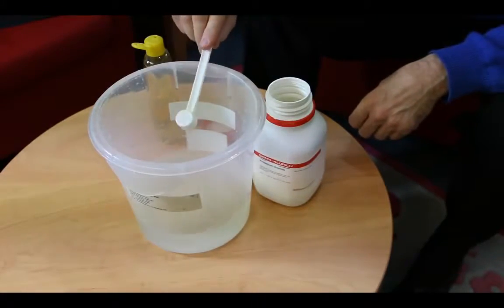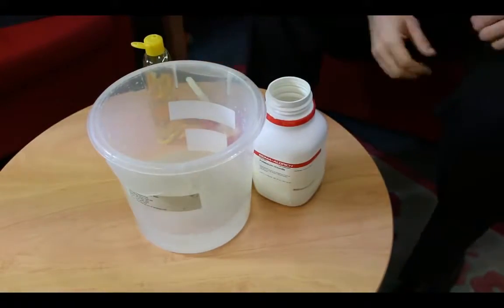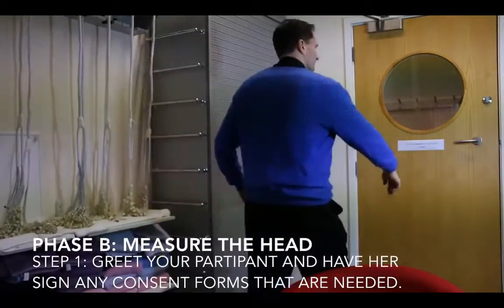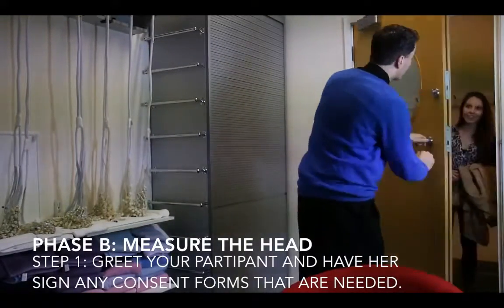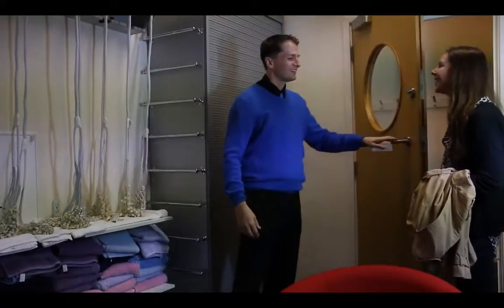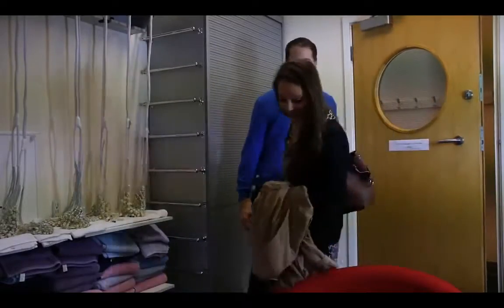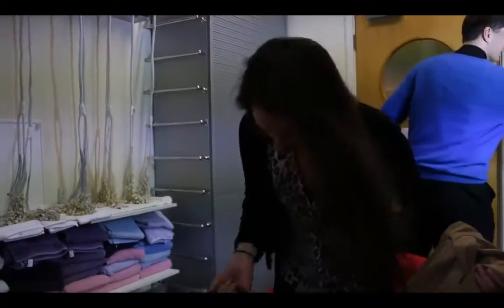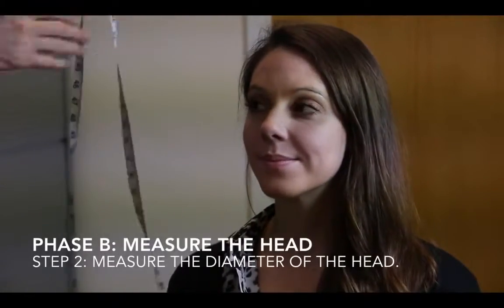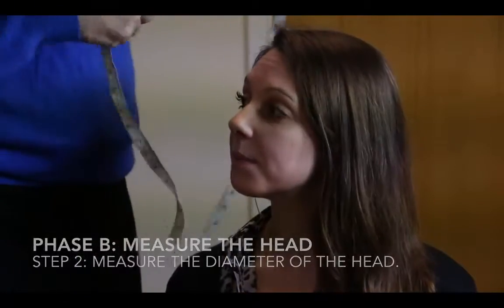The second phase of collecting EEG data involves taking various measurements of the participant's head. First, greet your participant. Have them sign a consent form if needed, and explain what the experiment is going to be about. Next, you're going to measure the diameter of the participant's head. This is to find out the exact cap size which the participant will be using.